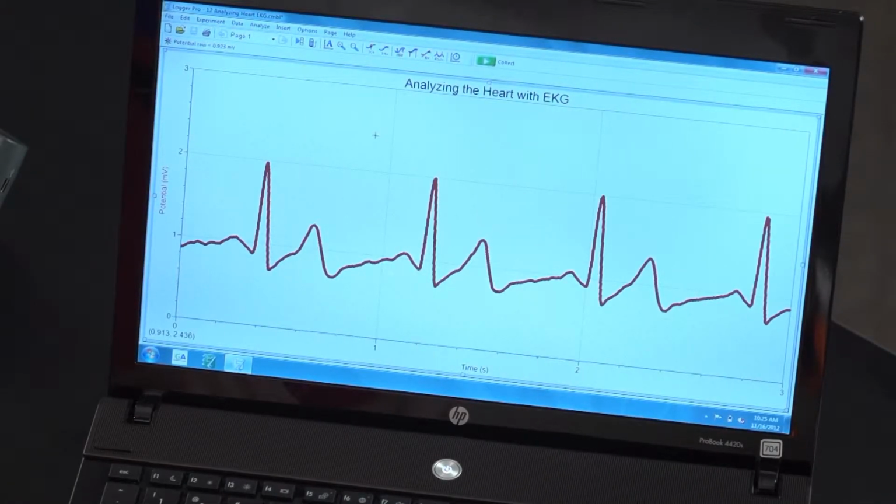So let me just show you a few things about this EKG trace. Because in looking at an EKG trace, you can learn a lot about physiology and anatomy. So I'm going to go over here. I'm going to zoom in on this single EKG trace right here. And I do that by hitting this icon right here, which is Zoom In.